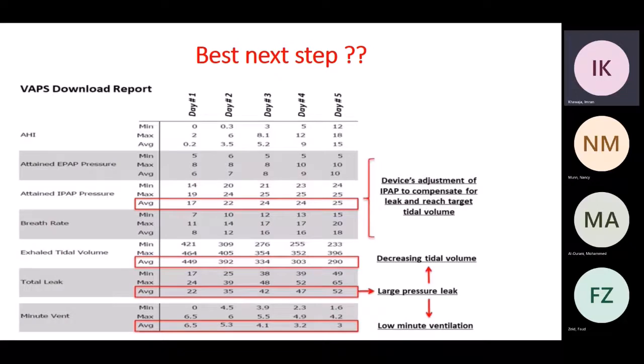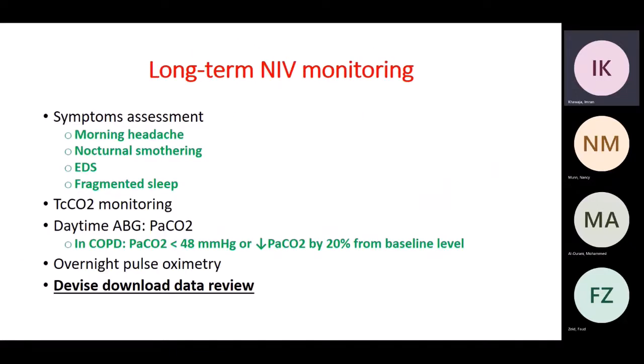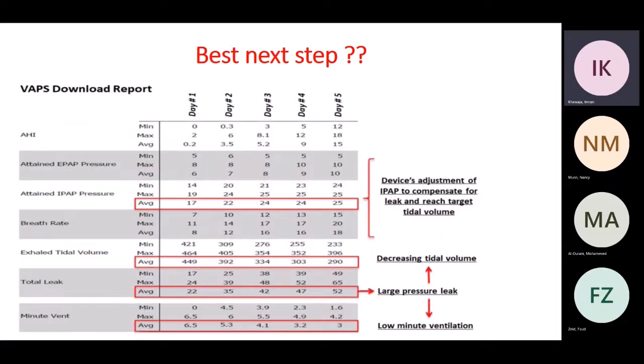And you might see the scenario. What do we mean by unintentional and intentional leak? So you have a mask, right? Because it's one tubing connected to the machine. If there is no leak from the system, then you will be breathing your CO2, right? So there is an intentional leak.